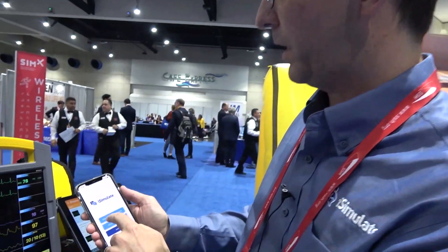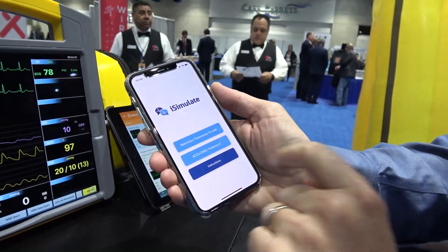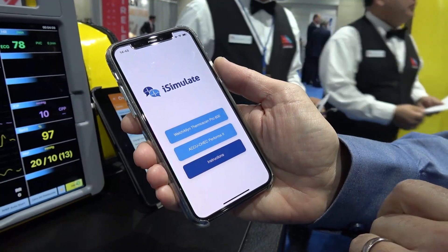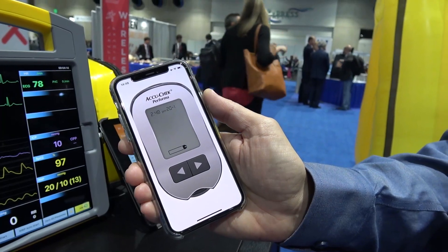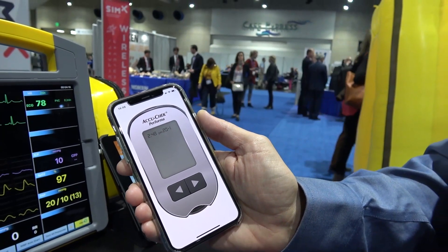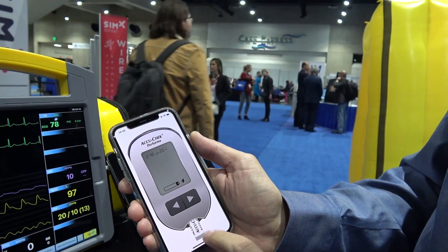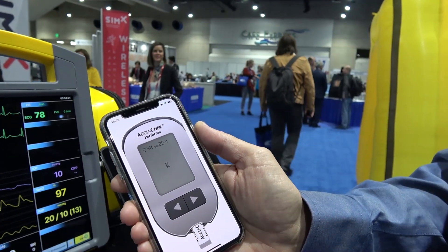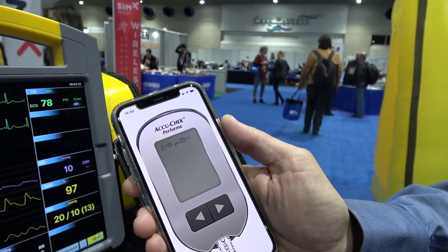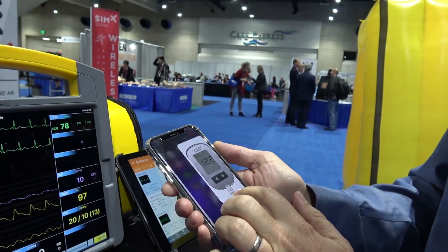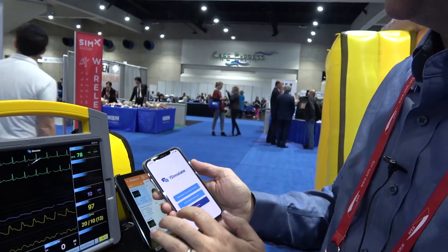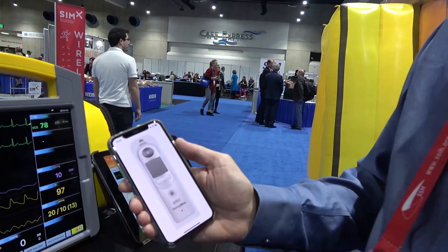We've now branched into small devices — this is really just a beta release to show you what's coming. We've now got a thermometer and a blood glucose monitor. You can see it looks exactly like a blood glucose monitor; we can add a strip, tap on the blood sample, and then it takes a bit of time to register, just as with a normal device, and we get the blood glucose level on there.